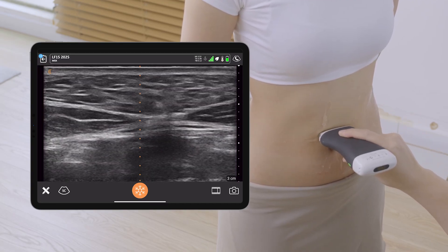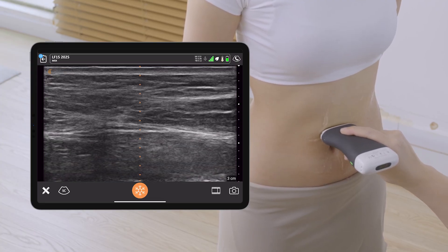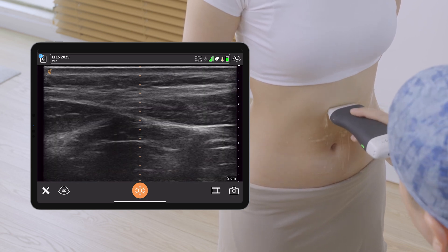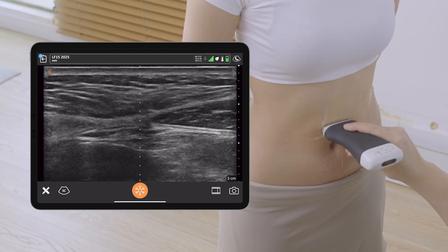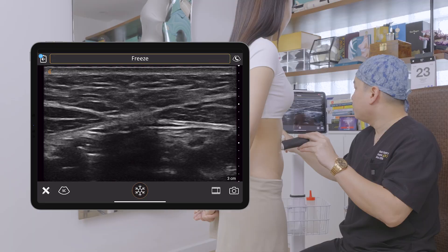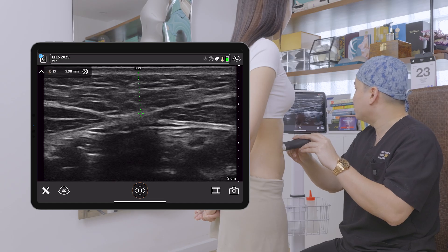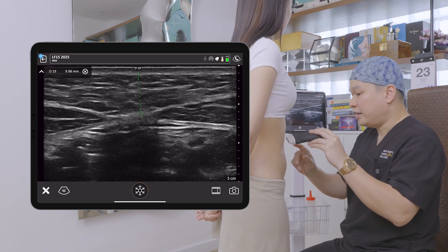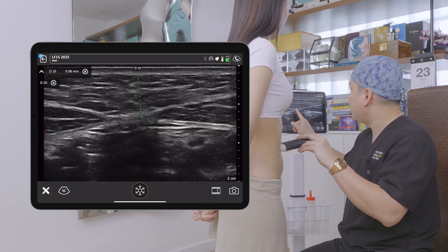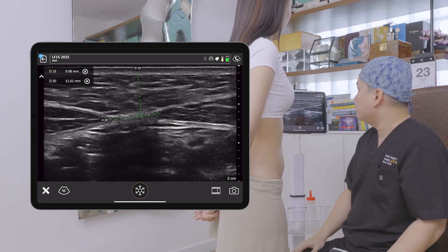The linea alba is very obvious in thin and athletic individuals — this is the line you see in people with six-pack abs. This is the midline. You can see a little bit of this midline in her, although it's not that obvious because she has a moderate amount of fat, about 1cm above the linea alba. But this is a good position for us to measure the width of the linea alba, which is about 11mm.